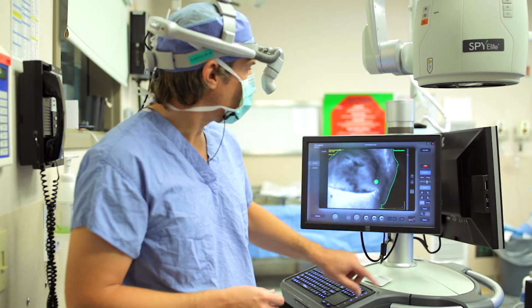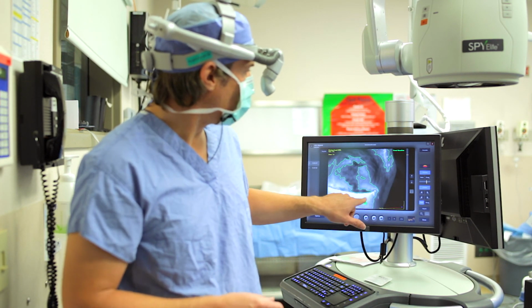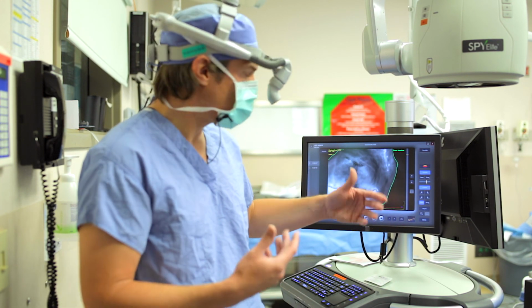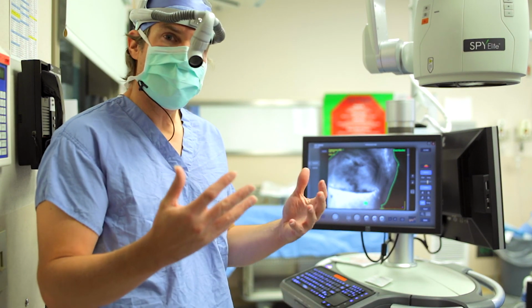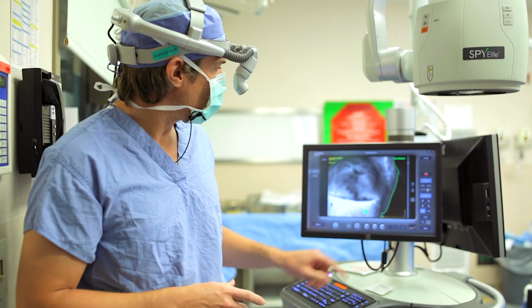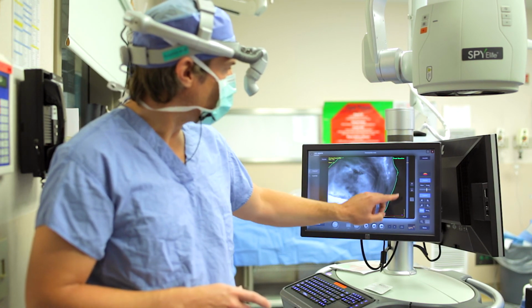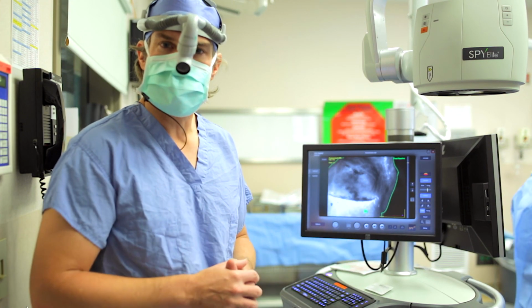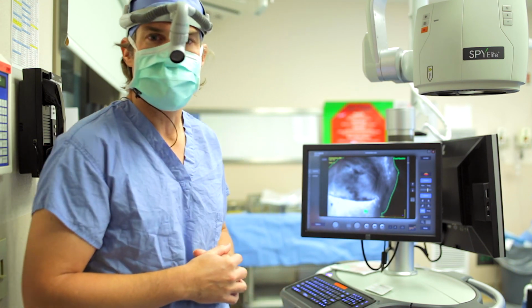If we wanted to look at it in a relative value and bring up an area that is relatively 100% perfused relative to the other areas, and show me areas, again, that other surgeon that I was telling you about, Marty Newman down at Cleveland Clinic in Florida, he's come up with a number: mastectomy flaps that have less than 20% relative perfusion are going to have troubles. Here's where we're now looking at relative numbers, 100% perfusion here, and I've asked the machine to outline the areas that are less than 20%, and you can see I have none of the areas on my reconstructed breast that are less than 20%. I know I'm going to be able to leave the operating room confident that I'm not going to have perfusion issues with this patient.